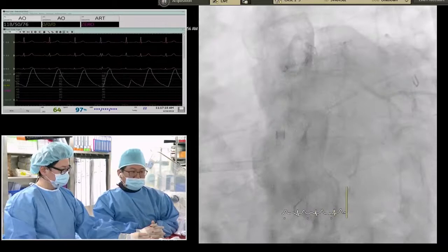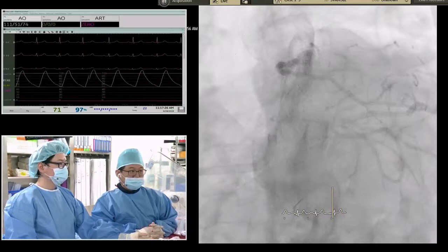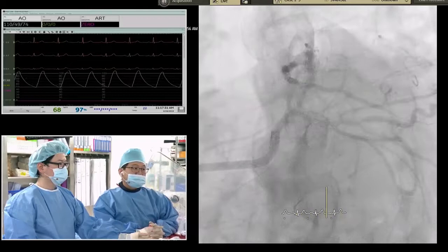Well, so I'll tell you why I would do the FFR. You can notice there's diffuse disease in the circ up until this marginal branch. So if the FFR is positive, then I'm going to do a two-stent technique, including a long stent up until that point. If the FFR is negative, so it's not such an important territory, then I may do a crossover. I may end up ballooning the ostial circ to keep it open, but I would worry less about it.